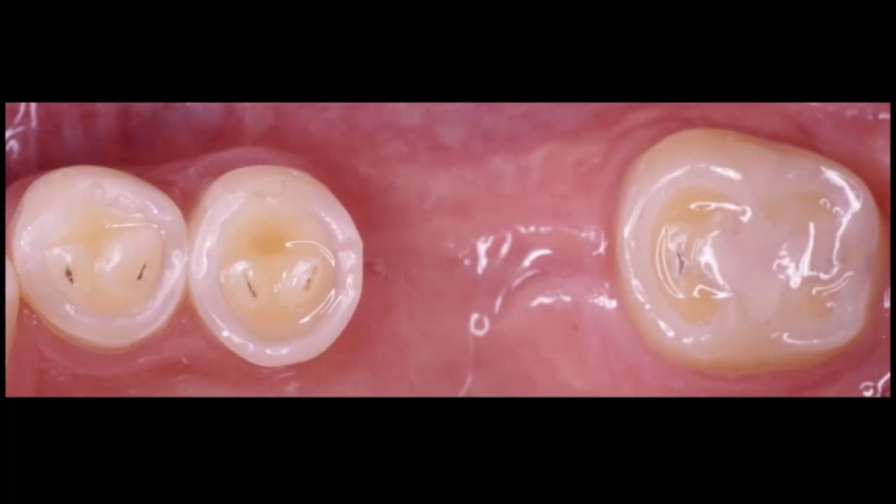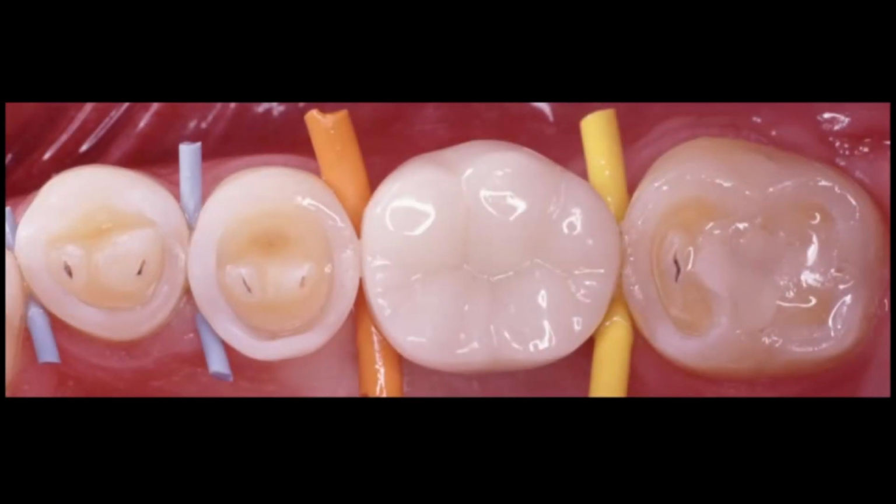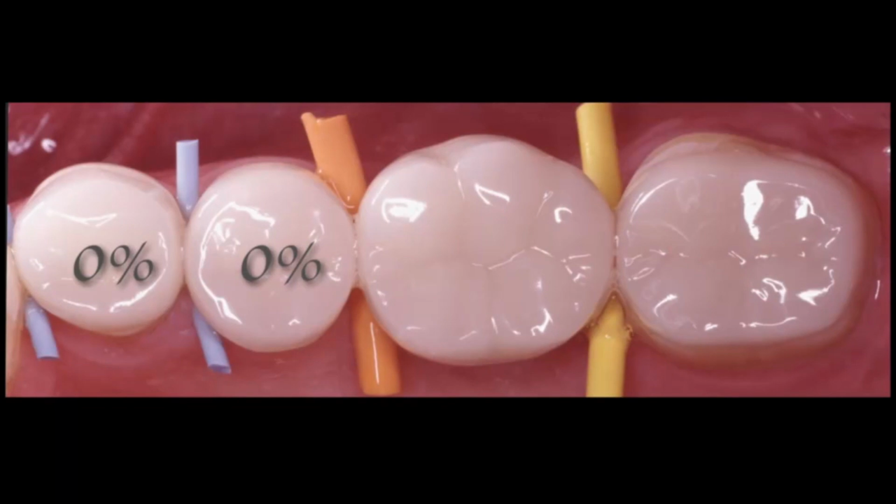And we thought about placing an implant, and we did a test drive with a prototype of the Telio CAD at this time. So this is a color which is not very favorable. It's changing now; we have HD ingots. At this time it was not possible to access, and that was the whole first step of the functional test drive. So it's not a removable splint, it's a permanent splint, which is much more efficient to test drive something.